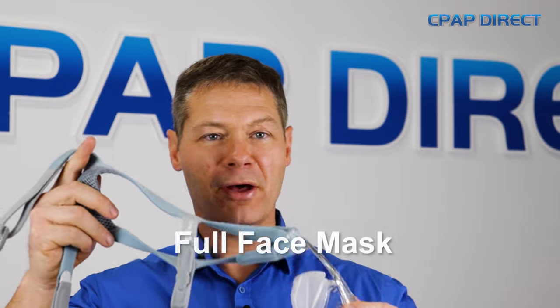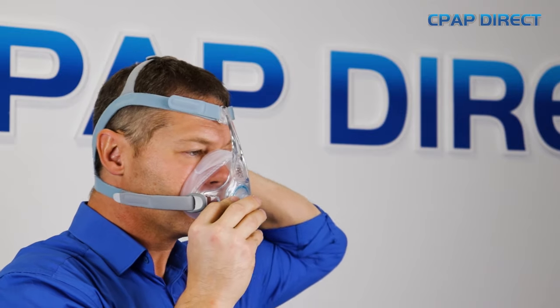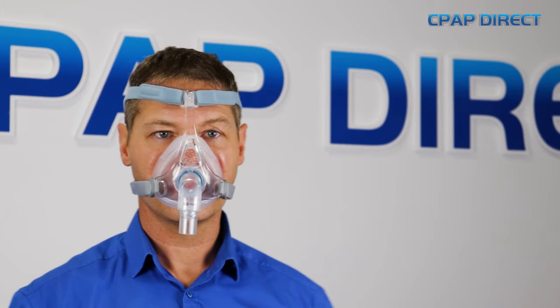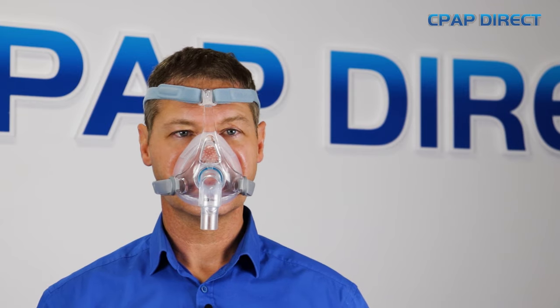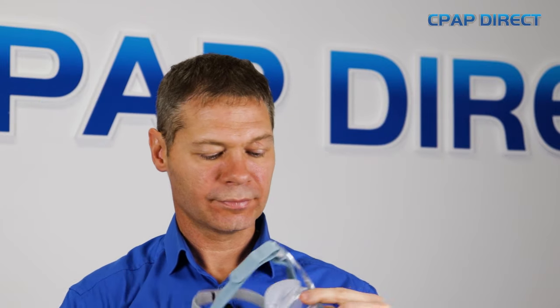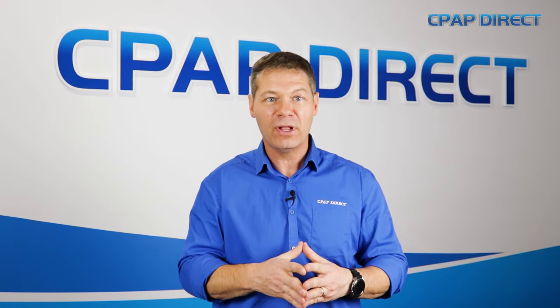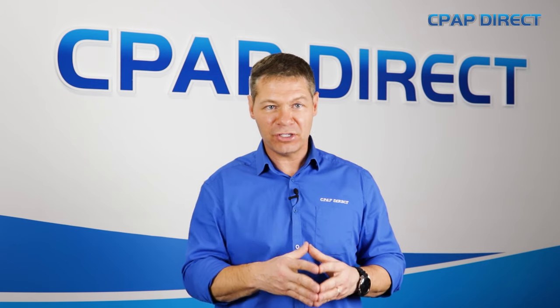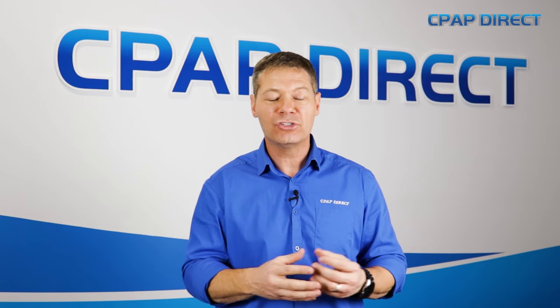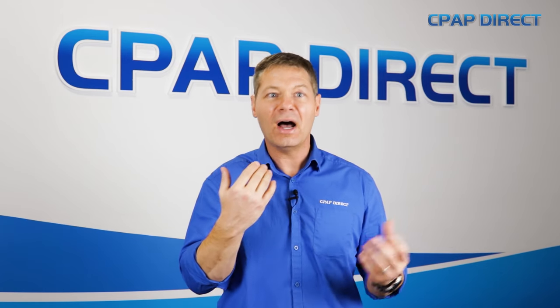The last type of mask is a full face mask. Full face masks are really the only option for people that have badly broken noses or deviated septums, severe sinus issues, and can't use their nose. They're also great as a backup mask for anyone that normally uses a nasal mask but has a cold or the flu and needs to breathe through their mouth as well. You can use nose or mouth — there's plenty of air inside the cushion to draw from and it's comfortable. The downside is that because they're a larger shell on the face, they will all leak some amount of air, and if you have a lot of facial hair they can be hard to seal.